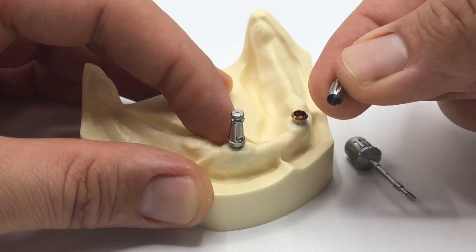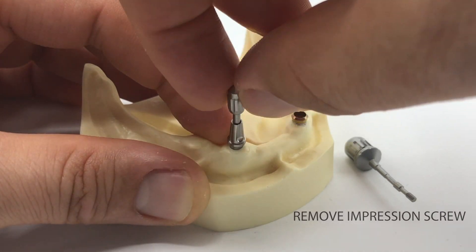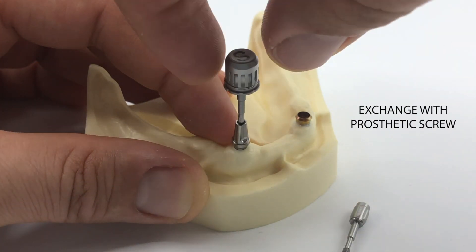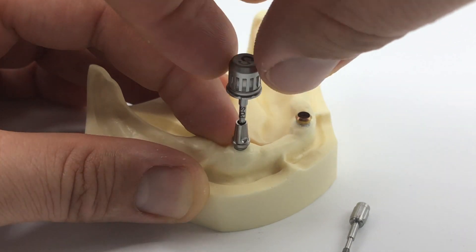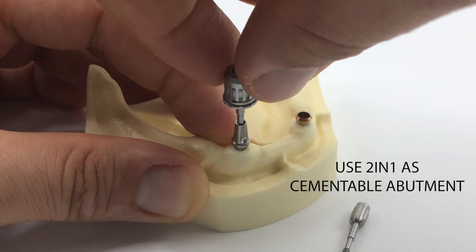After the plaster model is finished, use the handle for a last time to remove the impression screw out of the 2-in-1 impression abutment. Exchange the impression screw with the prosthetic screw included in the packaging. And now the 2-in-1 impression abutment is a nice cementable abutment.